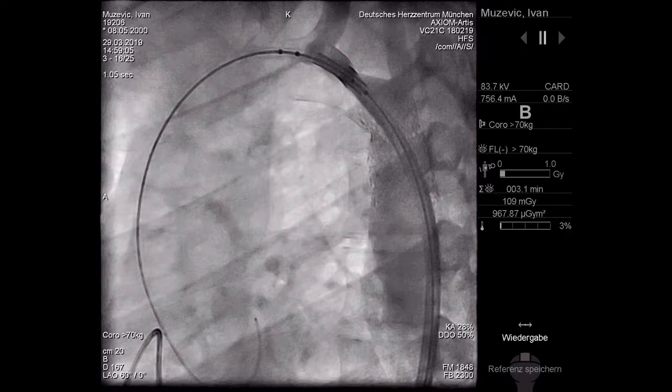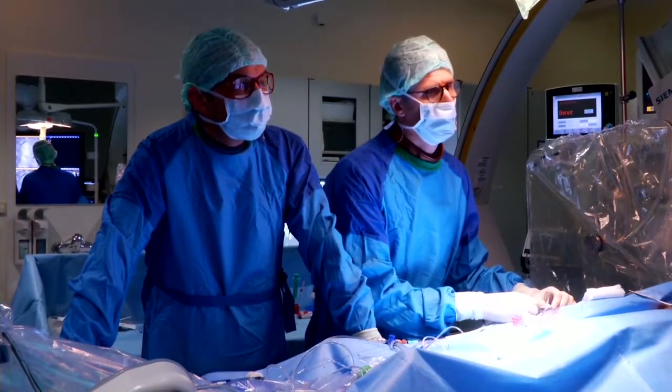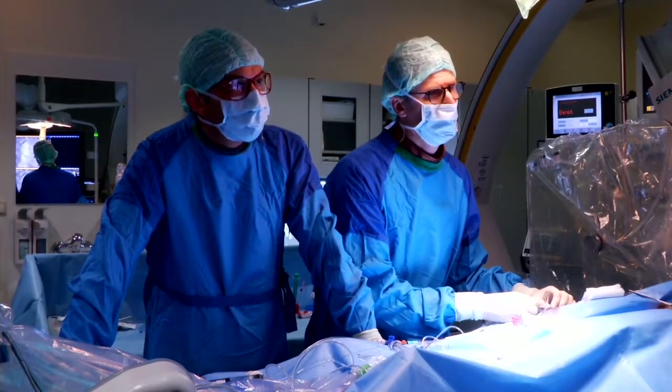I mean, how worried are you of potentially milking the stent back proximally? I know you discussed it a little bit, but millimetres here will make a big difference, and I'm wondering whether you're very confident that you're going to stay stable in the centre of the balloon with your stent having moved back a little bit. So you want me to push the stent a little bit more upward? Well, no, it's on the balloon. I wonder, do you have any techniques for doing that in the position you're in? Would you risk catching the edge of the stent and edging it forward, or is that too risky? I just wanted to see what your thoughts were about that.